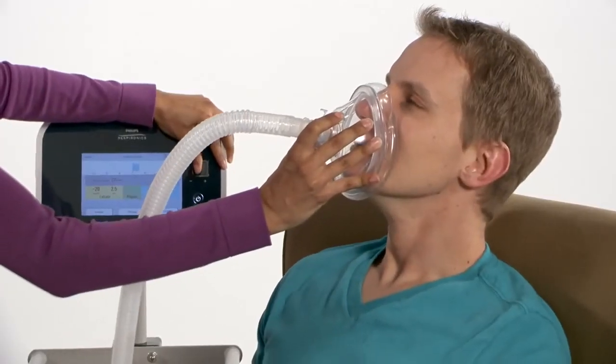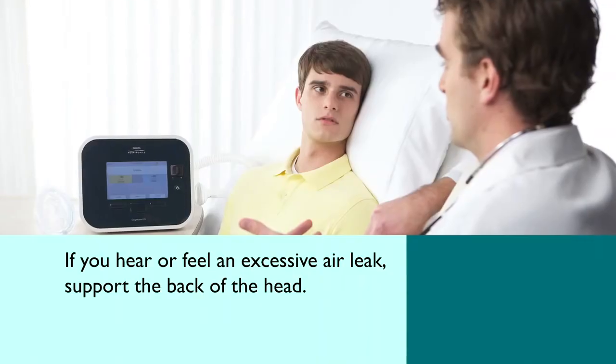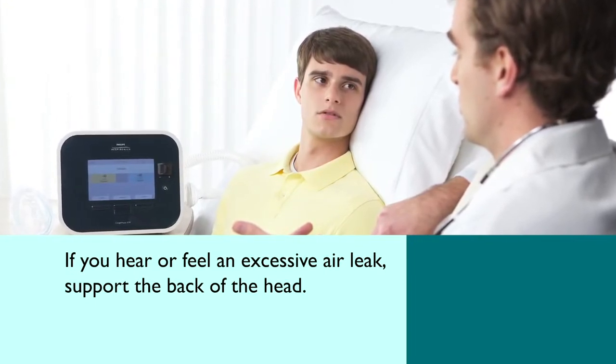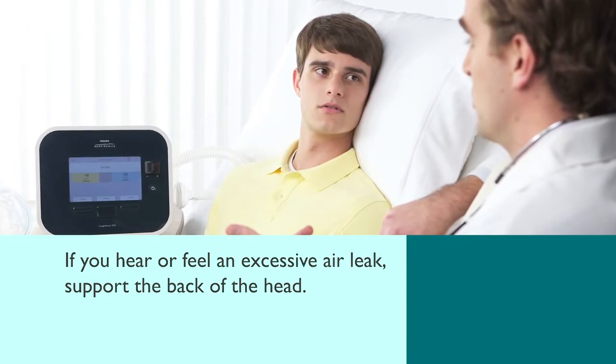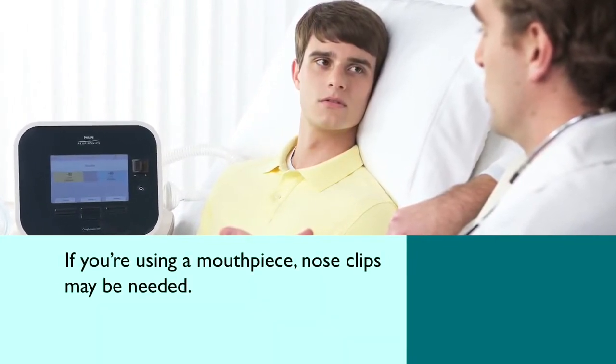When using a mask, make sure it is well fitted to eliminate possible leaks. If you hear or feel an excessive air leak during the inhalation period, support the back of the head with your hand or a pillow to improve the seal. If you're using a mouthpiece, nose clips may be needed.